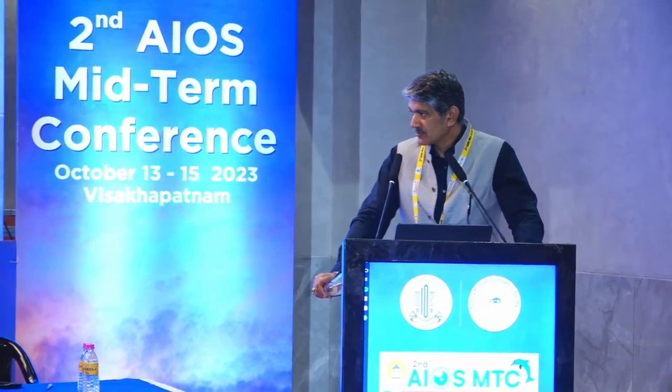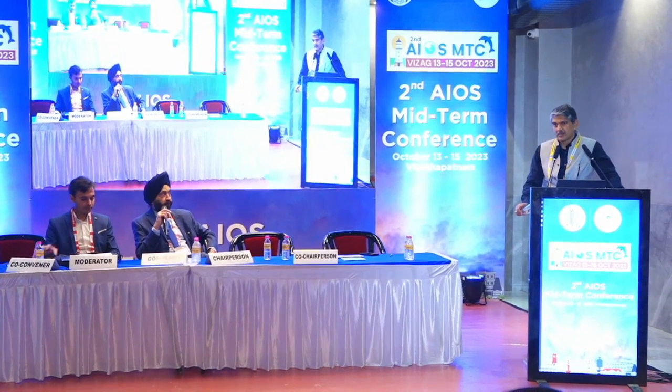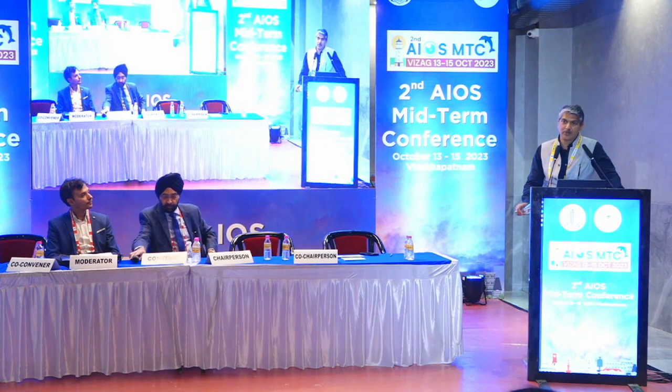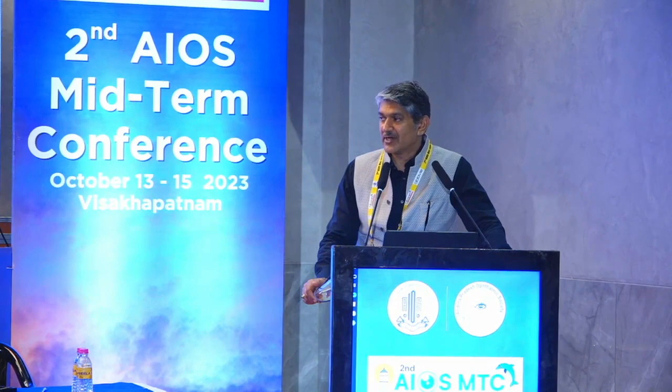And the third thing was the surgical proficiency required to remove the lenticule. Do you feel it's still difficult for people to adjust to getting the lenticule removed? I think it is a surgical procedure. The learning curve is a little more than LASIK and definitely more than PRK. So you need some amount of surgical finesse. If you are meddling in the interface for a long time, you will have more inflammation and edema, and visual recovery will be delayed. So surgical finesse and technique definitely contribute to early visual recovery. Thank you, Shri. Thank you.